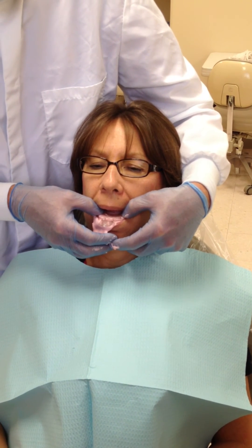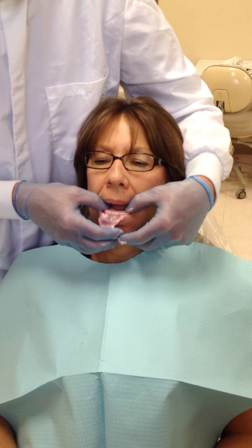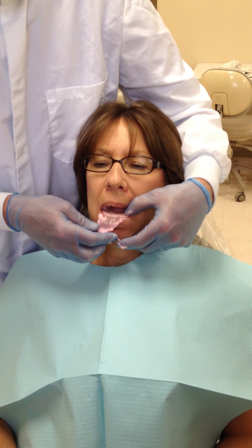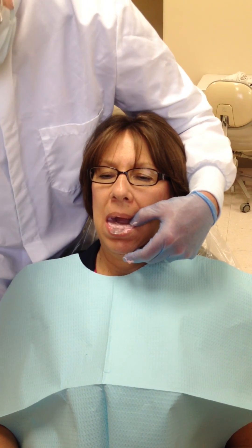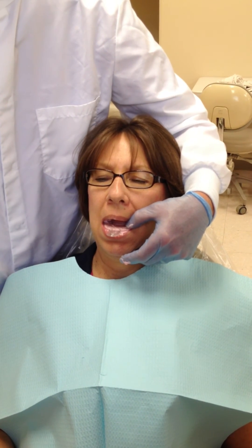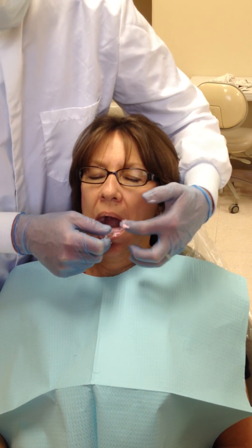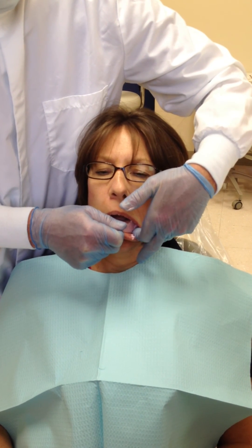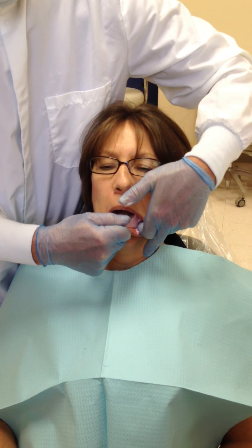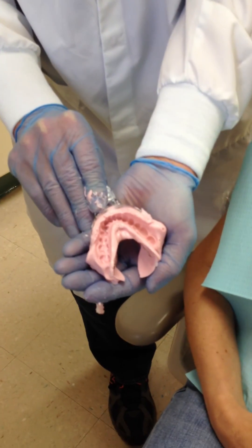We are almost there. One piece — clean up. Breaking the seal posteriorly. We have our lower impression. Nice.